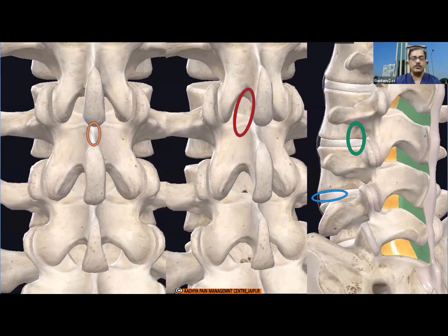Now, to go into the epidural space, we have different acoustic windows. One important acoustic window is between the two spinous processes here, through which we all give the spinal epidural. Another important one, particularly when we are thinking of doing it under ultrasound or even under C-arm, is this gap, which in the lumbar area is a very big gap. Through different windows you can peep in when we put the ultrasound probe, so the acoustic window. This is one acoustic window, and this is another, in the interlaminar area.